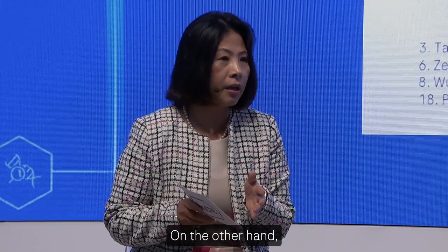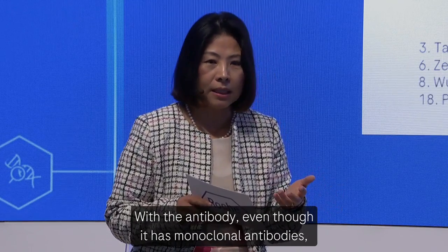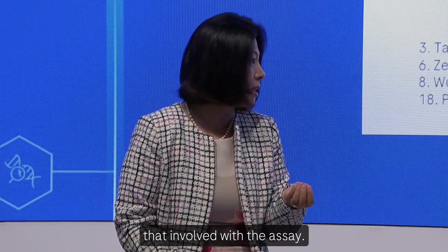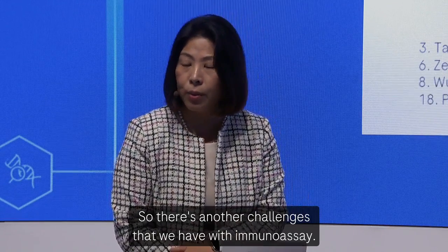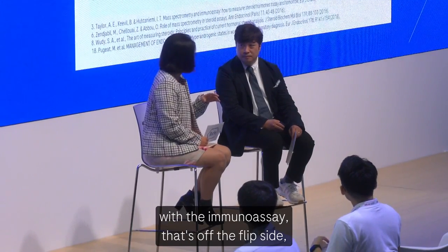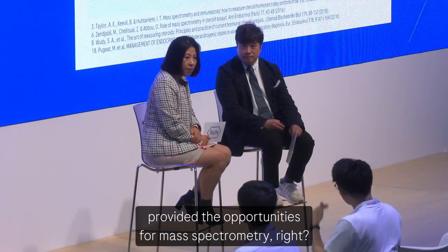On the other hand, some of the immunoassays, we know, are antibody-based. With the antibody, even though it has monoclonal antibodies, there's still some interference that's involved with the assay. So there are other challenges that we have with the immunoassay. As I talk about the limitations of the immunoassay, on the flip side, I think that provides the opportunities for mass spectrometry.